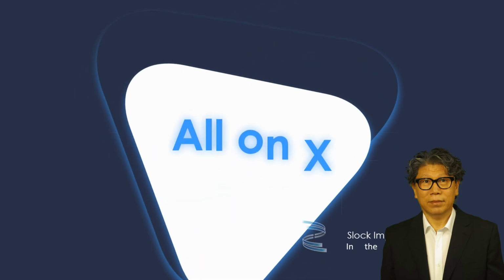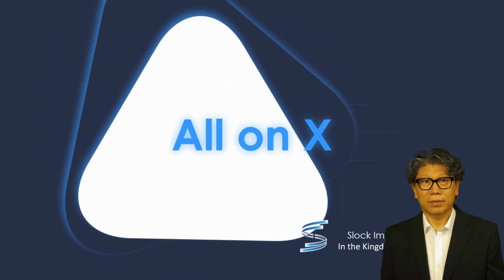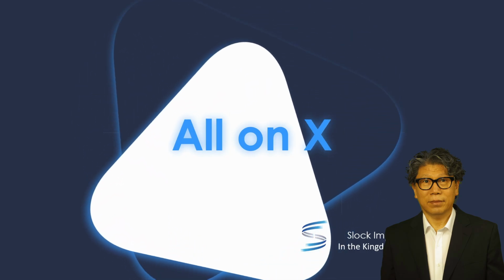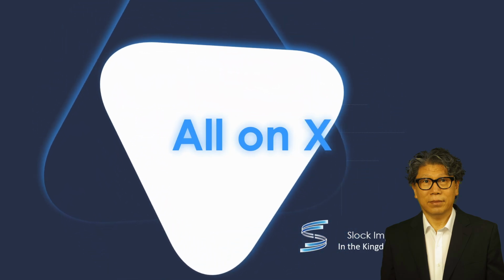When lip support decreases in the maxilla, patients often describe their face as appearing sunken. In that sense, removable dentures may actually provide better lip support. In my experience, cases treated with maxillary full dentures and mandibular AllonX have shown no significant problems.